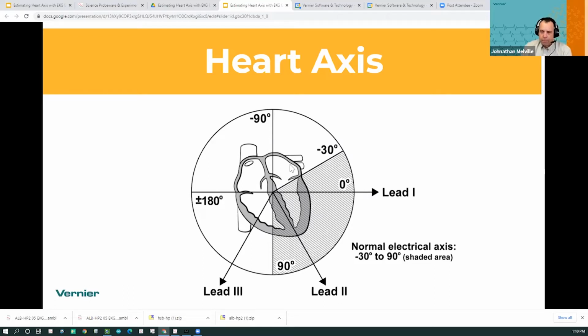Now, if you were doing a clinical EKG, there's lots more leads that you would record with. So if you were to go to a doctor, or a cardiologist, that actually wanted to look at your heart, they would do several lead EKGs. In this diagram here, we're just showing you 3 leads. 3 leads basically means that they're recording from different positions. And what they can do is look at what we call the heart axis, which you can think of as, remember I was talking about the ventricles.